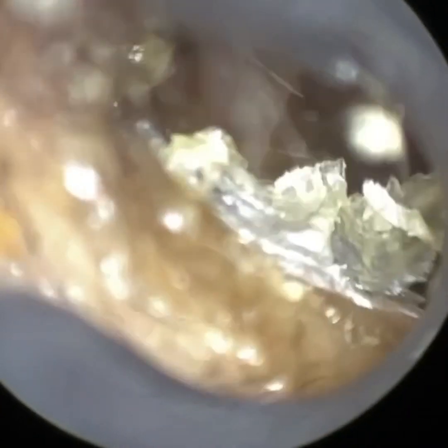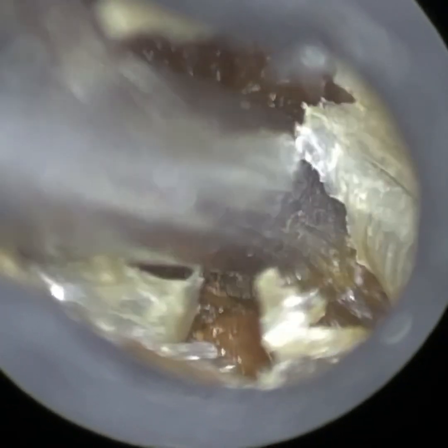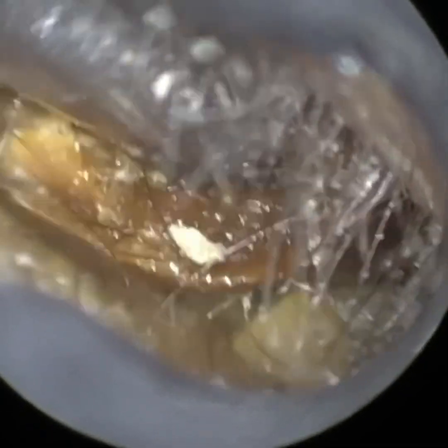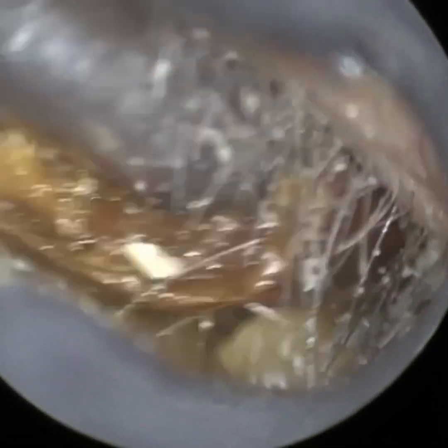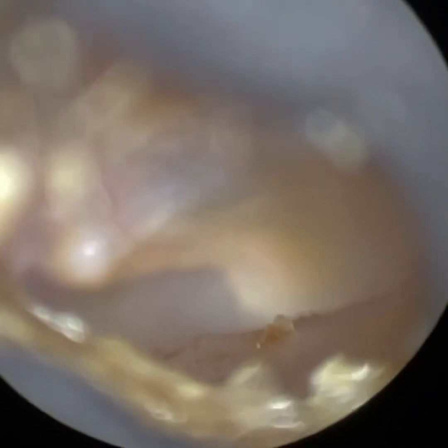Now, you can't compare the Waxscope to an endoscope. If you watch my other YouTube channel, you'll just see the difference in the view and the field of view. I would say the Waxscope, in terms of magnification, clarity, and zoom, is actually probably a bit superior to an endoscope. I would put the Waxscope similar to an ENT microscope — I've got one at the clinic myself — and it provides a very similar view in terms of magnification and clarity. So the Waxscope is designed to be the next best thing if you struggle to use an endoscope, because a few people do struggle due to the bilateral integration — your right-hand, left-hand working coordination.